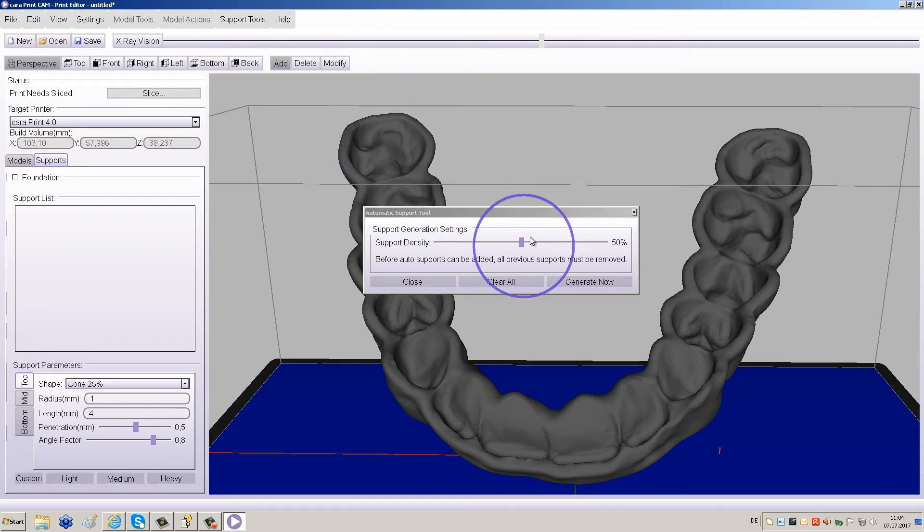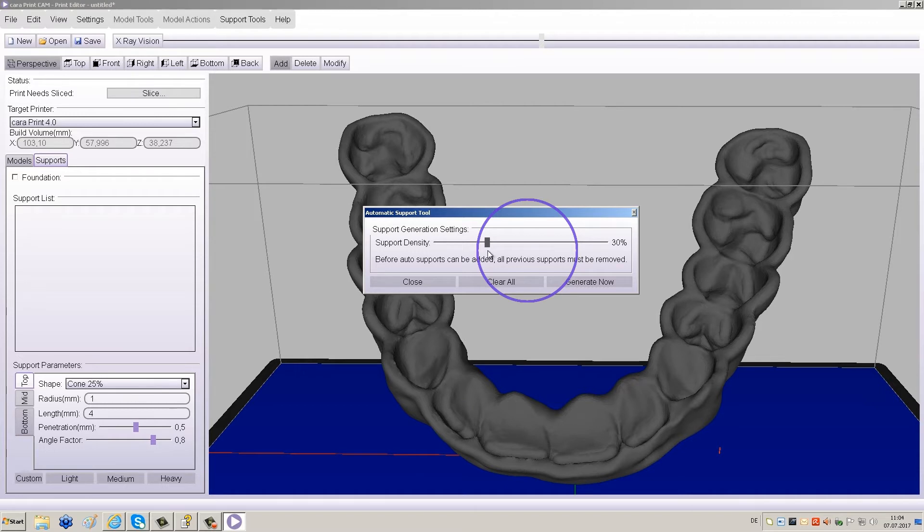Using the slider, reduce the support density to 20 to 40% and click Generate Now.